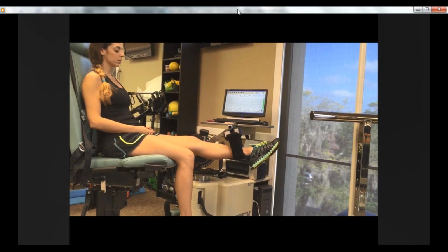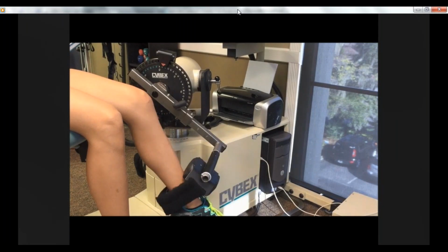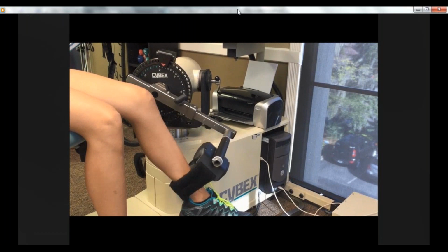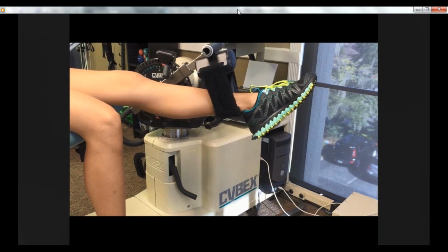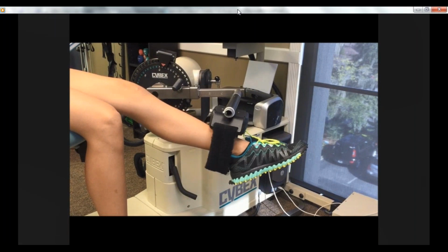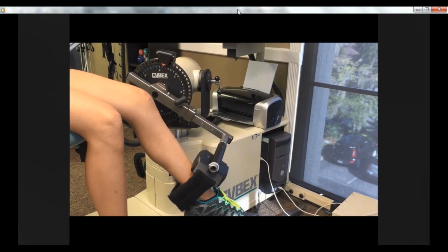Now, with our ACL patients, with some of them, you can start this as early as 2 to 3 weeks post-op, especially if they had a hamstring graft or the semitendinosus graft. You can start them earlier. Now, if they had the patellar tendon autograft, you might want to wait until week 4, depending on their level of comfort for this. But this is a very, very comfortable level of exercise for them at this point. It also is really good for helping them to get that full extension. And you can see, look at that tibia and how well she's able to control that coming down. You can just see the level of neuromuscular control required for this.